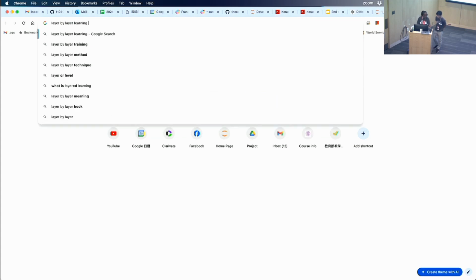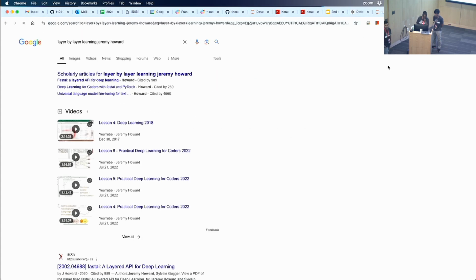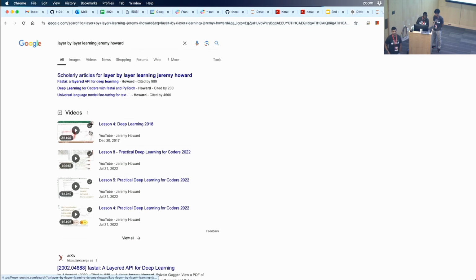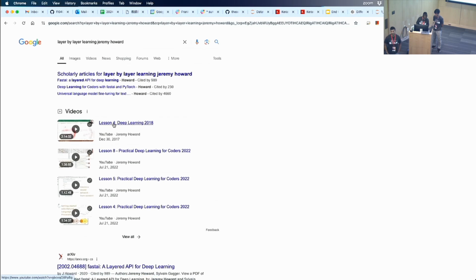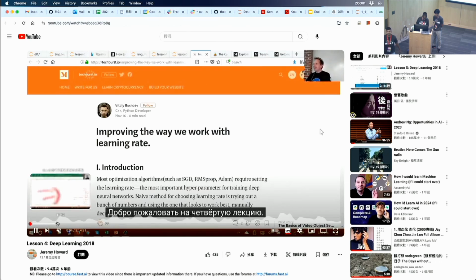So if you had to train the model from scratch using 1,000 or 10,000 X-rays, you wouldn't have enough data to train all of those layers from scratch, right? So what we do is we take the pre-trained weights and use those layers that are already pre-trained from the incoming data and then just tune the back end because we have data scarcity.